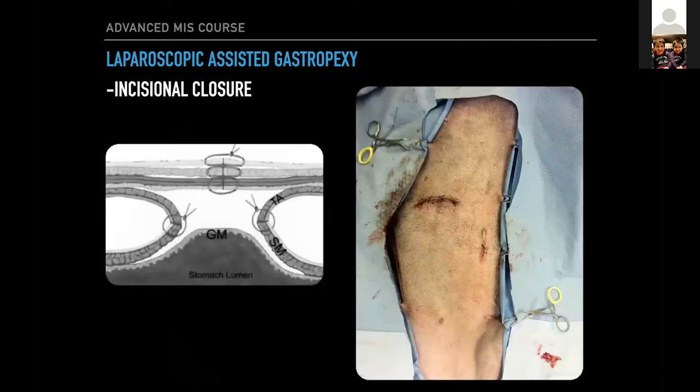There is the closure — do not take this lightly at all. If you're going to be doing assisted gastropexies, you are in for wound complications at this site. Try your very best to be meticulous with closure of your internal abdominal obliques, external abdominal oblique fascia, then sub-Q and skin. You can block this area with local anesthetic. These dogs are a little bit sore here — you're cutting through three layers of muscle, and this is seroma central. You can warn owners it's about a 30% risk of wound complications.